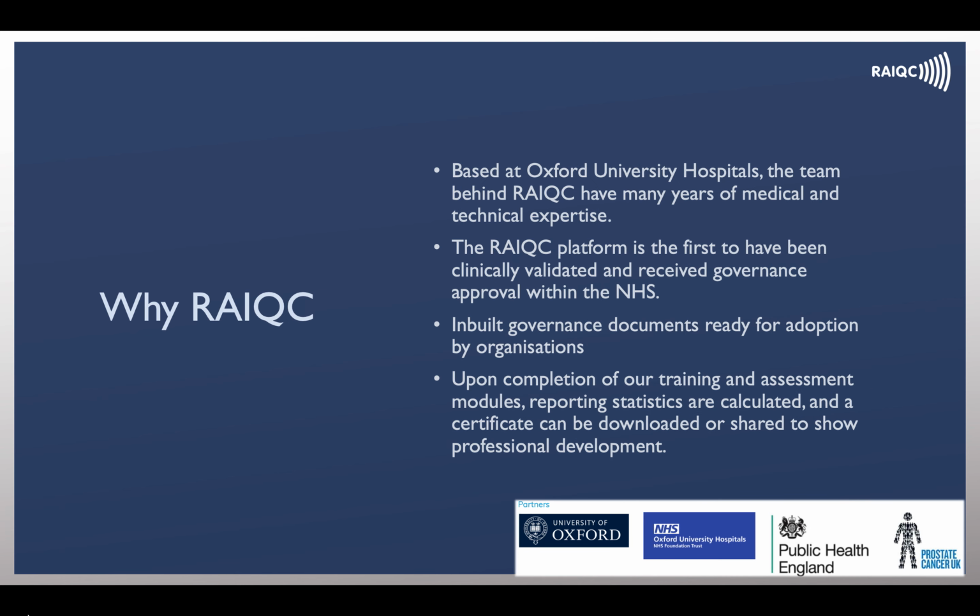So, why RAIQC? Based at Oxford University Hospitals, the team behind RAIQC have many years of medical and technical expertise. This has ensured that the platform has been clinically validated and has governance approval within the NHS. We've inbuilt governance documents ready for adoption by organisations within and outside the NHS. Upon completion of our modules, users are able to download certificates to add to their personal development portfolios and review statistics in which they can compare themselves with peers.